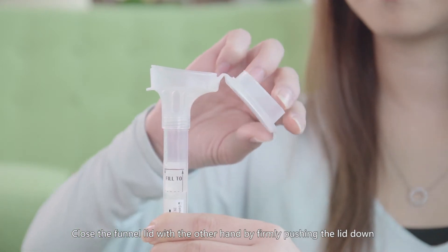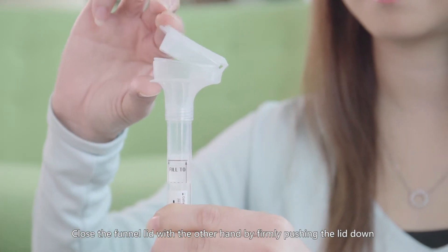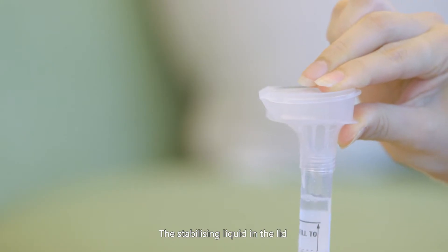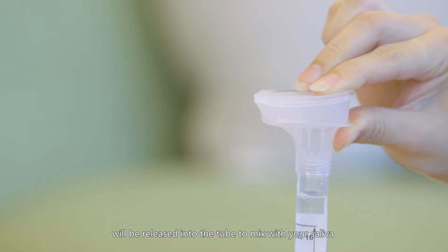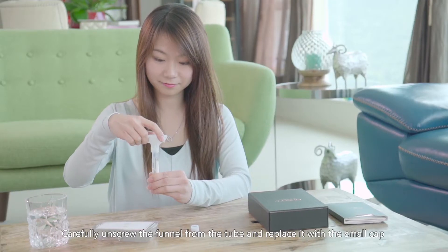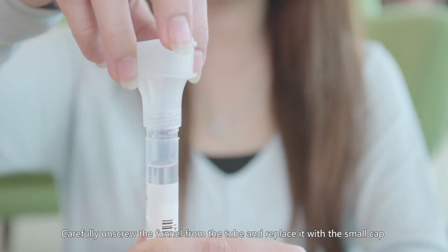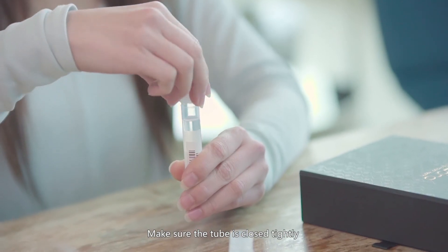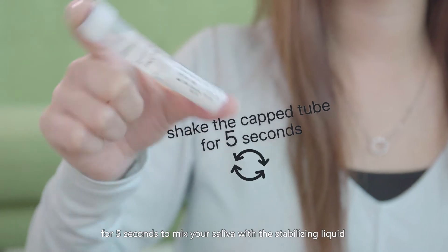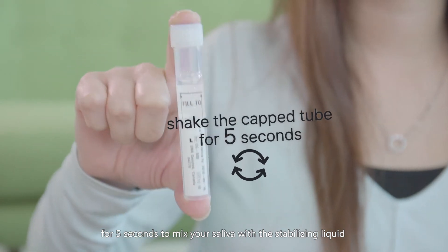Close the funnel lid with the other hand by firmly pushing the lid down until you hear a click. The stabilizing liquid in the lid will be released into the tube to mix with your saliva. Carefully unscrew the funnel from the tube and replace it with the small cap. Make sure the tube is closed tightly. Gently shake the capped tube for 5 seconds to mix your saliva with the stabilizing liquid.